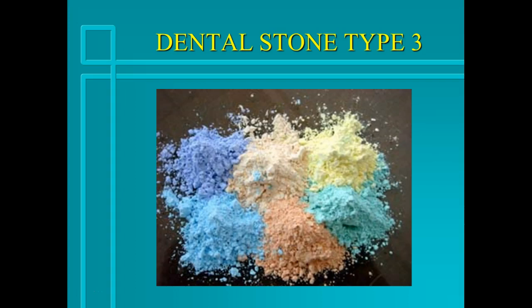And this is an example of dental stone type 3. So this is in powder form.